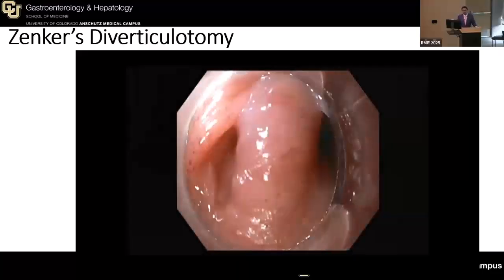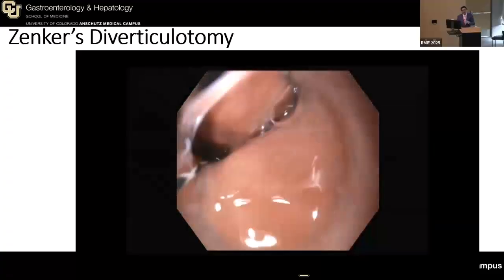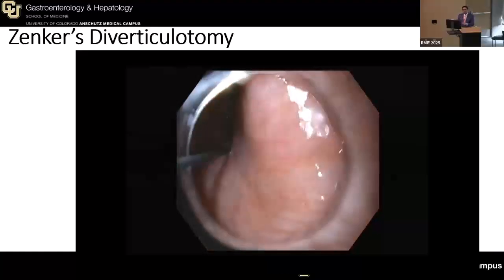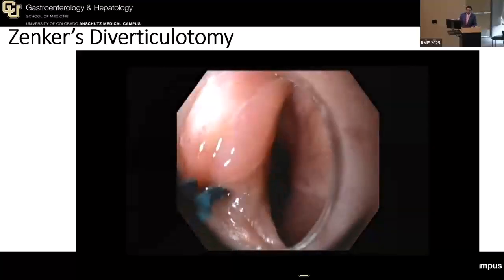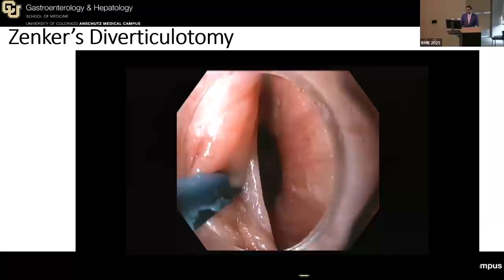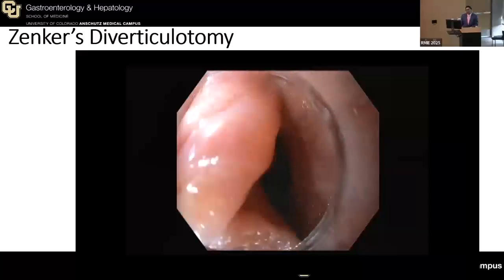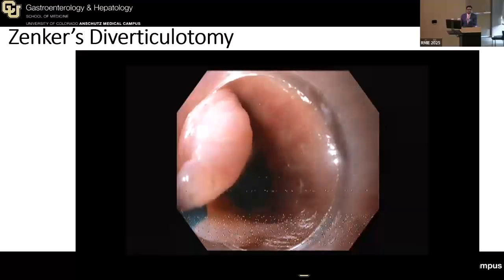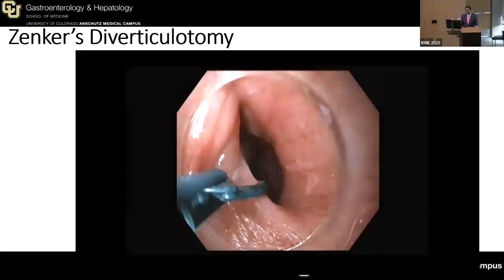So this is a Zenker's diverticulotomy that you're doing. There's a very thick septum, but a small diverticulum, but the patient is really symptomatic. Actually, a lot of our referrals come from ENT because it's hard for them to operate without a flexible scope in this tight space. I typically will leave a wire in the true lumen, especially when they're short diverticulums like this, so I know where the esophagus proper is and where the diverticulum is. And using a scissors type electrosurgical knife, you basically make a little mucosal incision and keep expanding your mucosotomy till you start seeing the cricopharyngeus muscle.